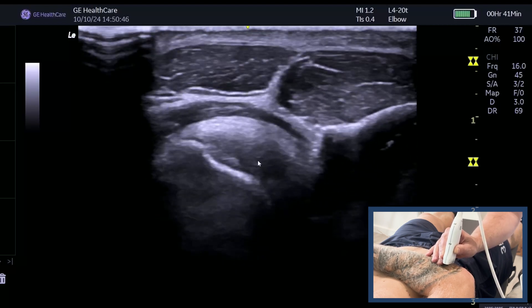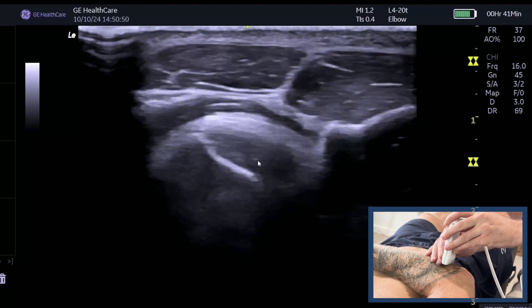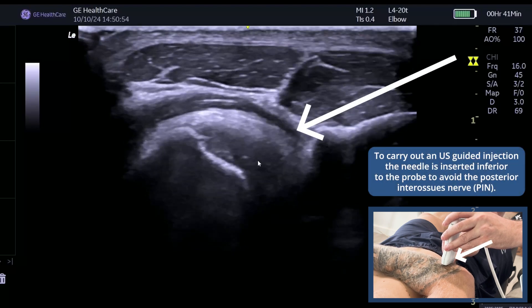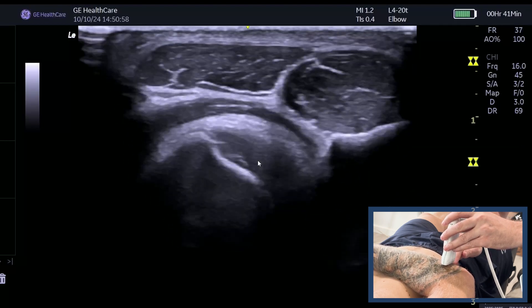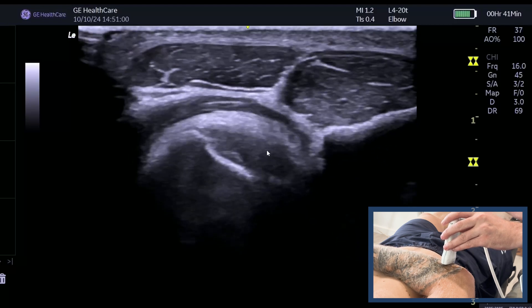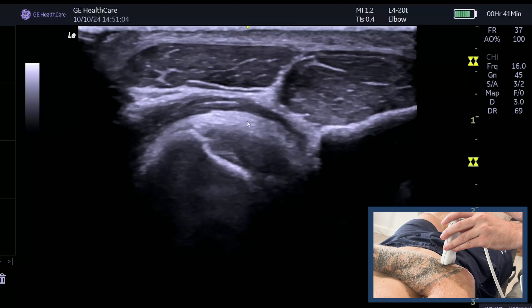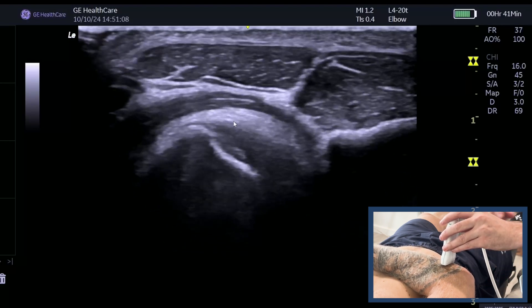This is the view I would use for an injection. If injecting, I would come from the inferior surface of the probe and inject on top of the biceps tendon here. It's a great approach because it avoids the artery compared to the anterior approach.